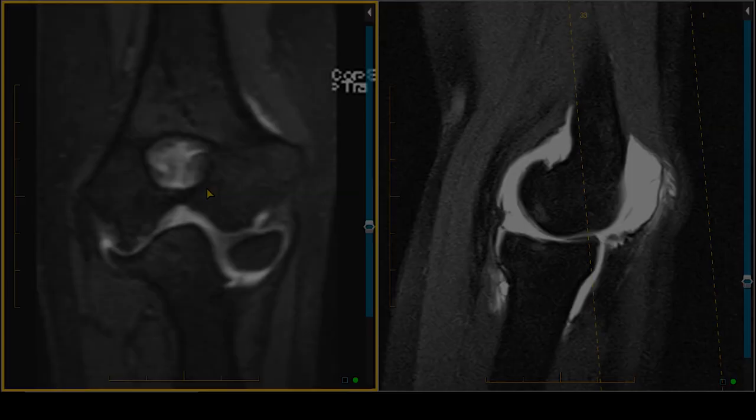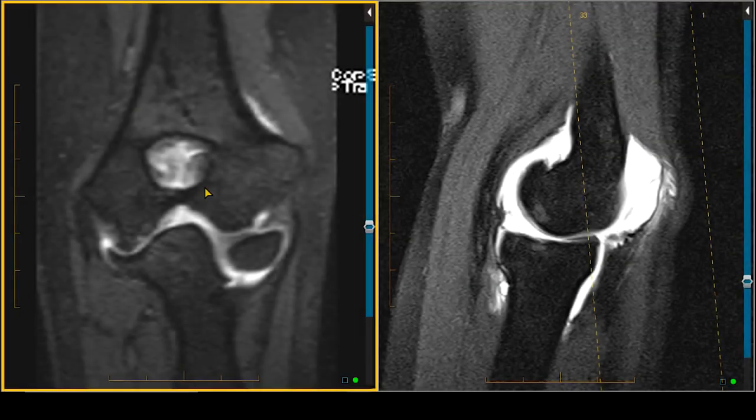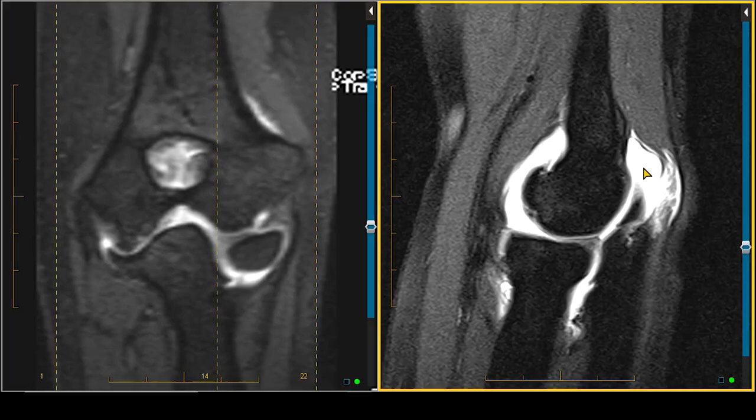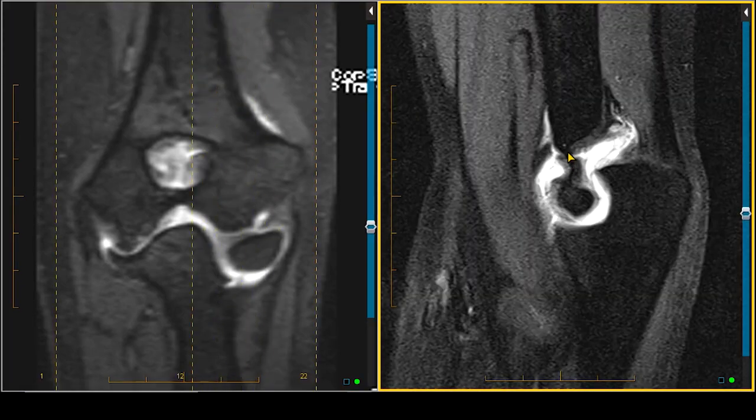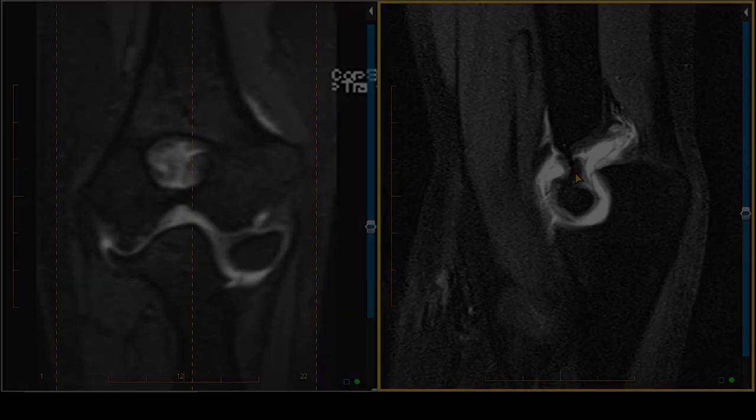What's happening? The history here is very important. This person, maybe four or five years ago, had a supracondylar fracture — remember we talked about that? It happens right here where the bone is very thin. So at one point this person had a supracondylar fracture.